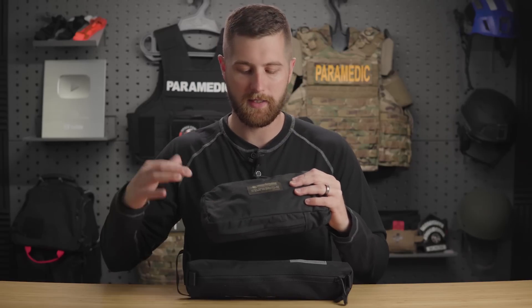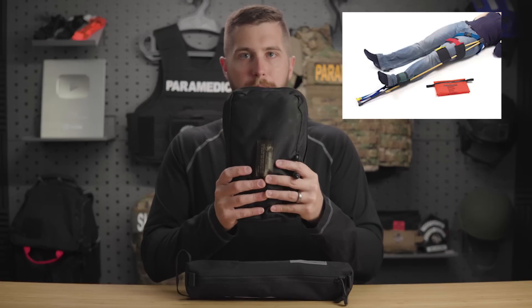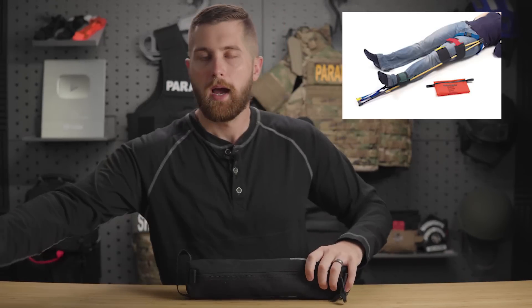Now in the past, I have used the KTD Kendrick Traction Device, which has been rebranded as the Tactical Traction Splint by North American Rescue. This is a great device and it's what I cover in my other video. It's basically a bunch of tent poles and comes in a package like this — pretty small.